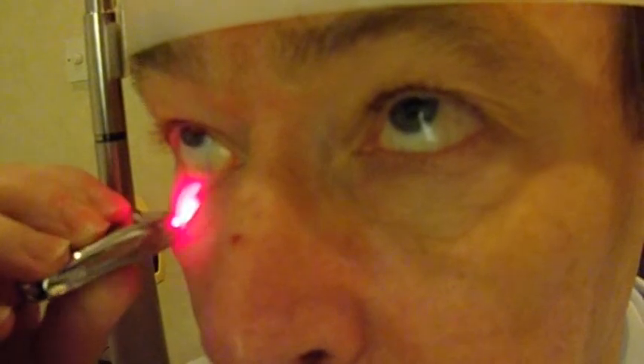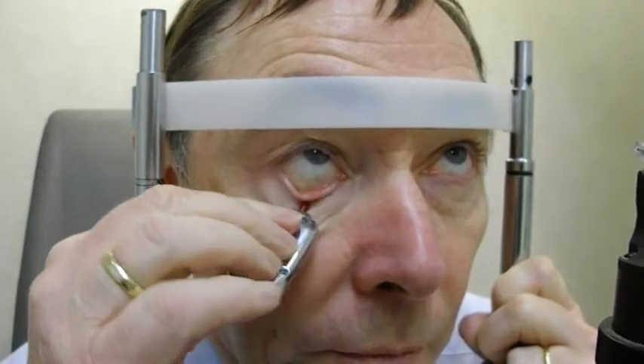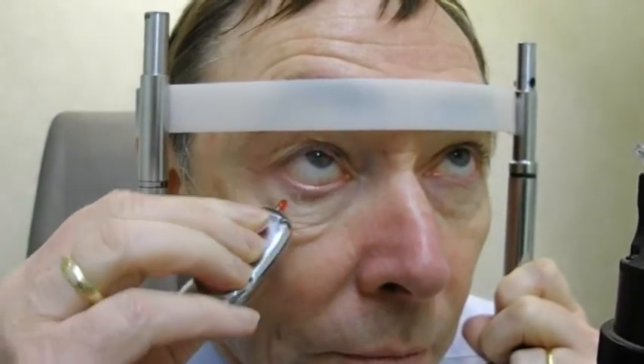The patient is seated at the slit lamp, the room is made very dark, and the slit lamp illumination is switched off. The patient looks up and the meiboscope LED is used to pull away the lower eyelid so the light can be shown through it.